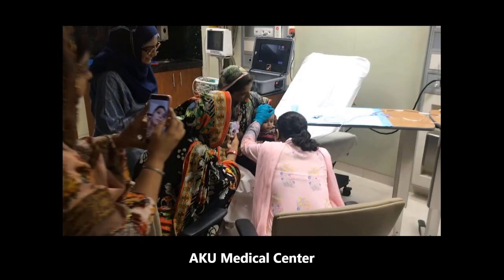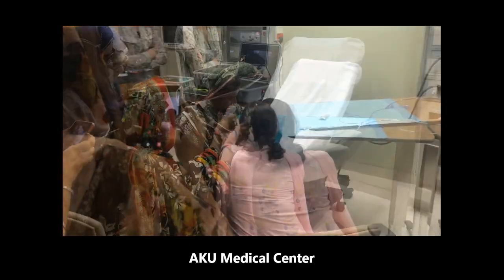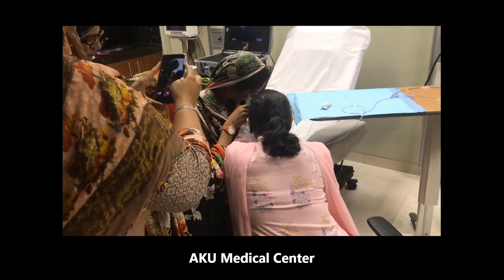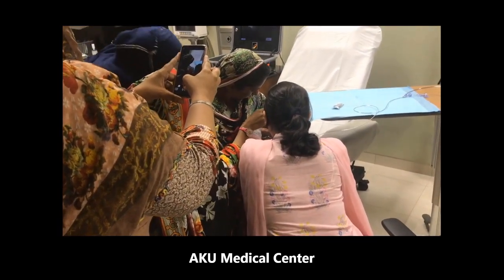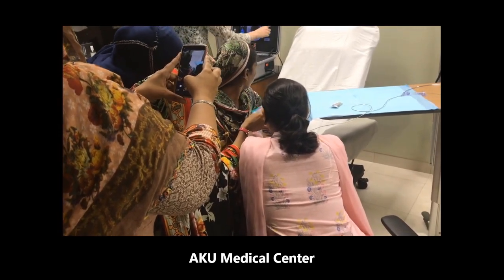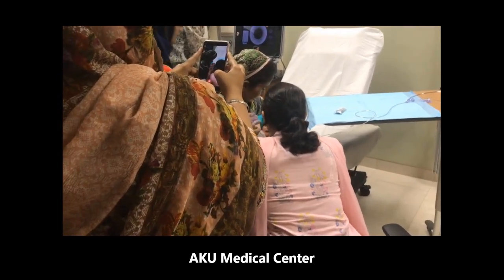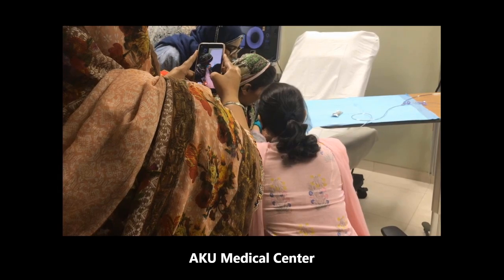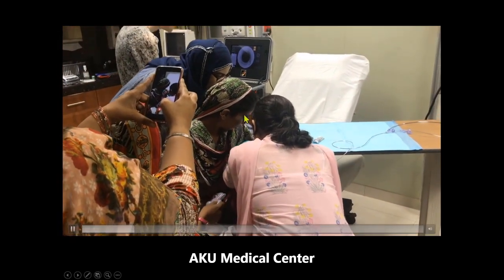This is just an example of a case that we did in an infant. This is a 6-month-old infant at the medical center there in Karachi in Pakistan. And we're able to insert it into the baby's nose. And then we're imaging on the OCT system, and we're able to image the baby's intestine. Let's see here, if I can move this along.